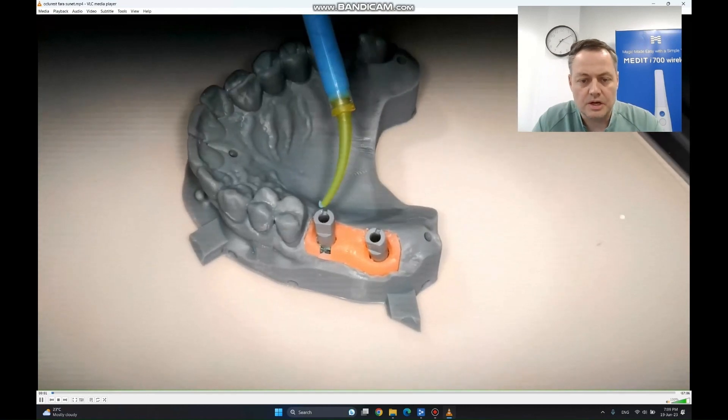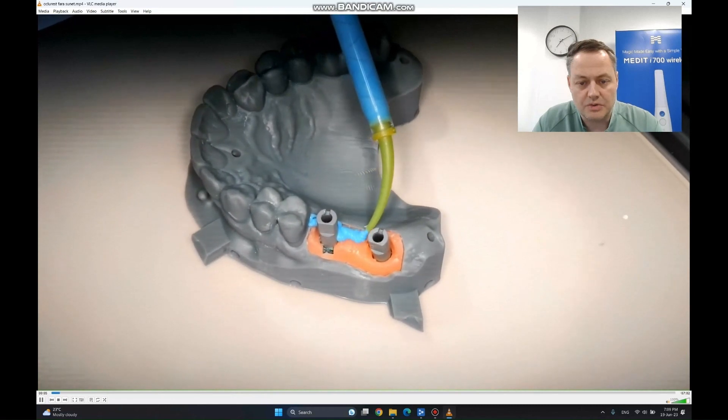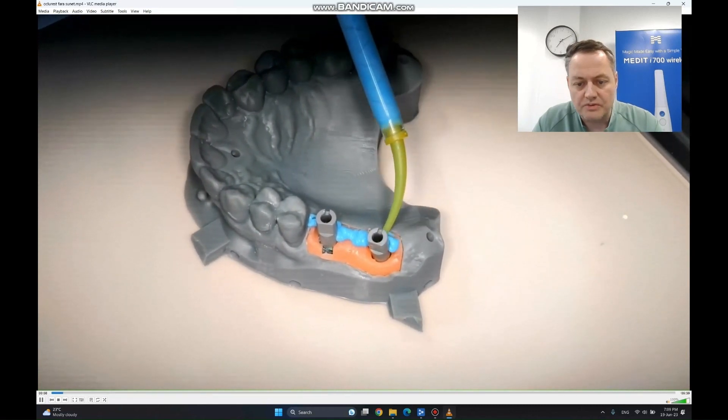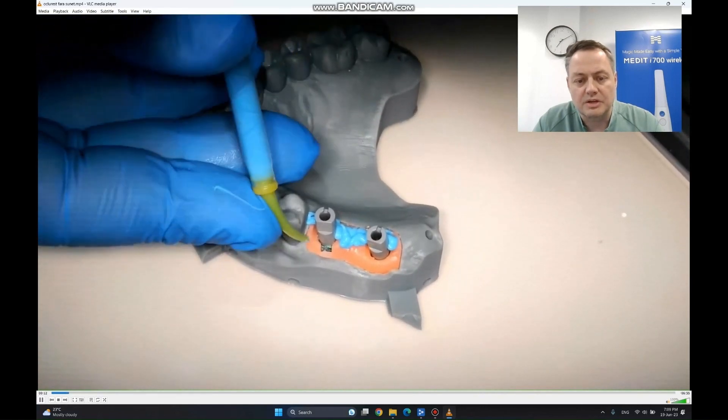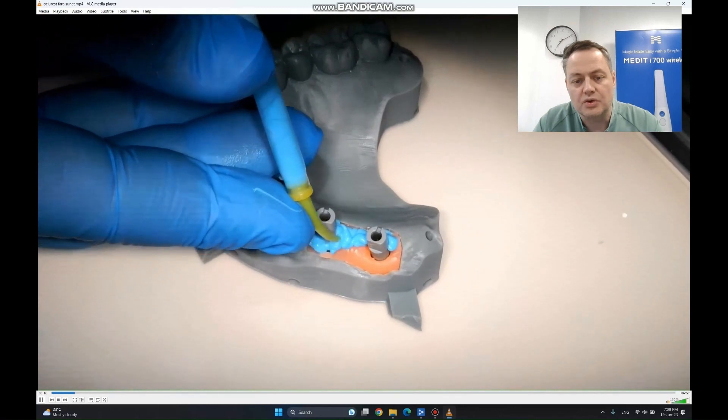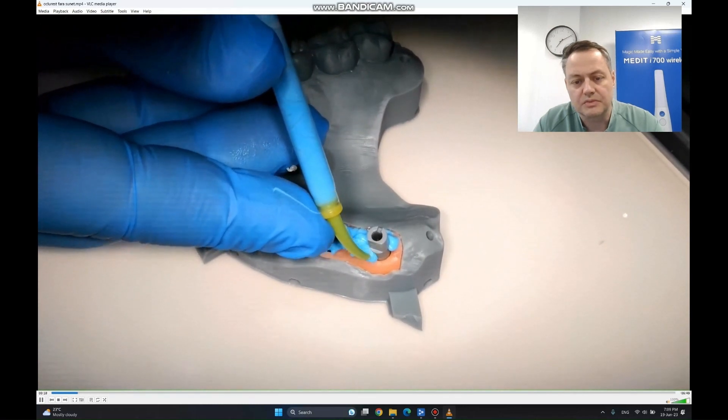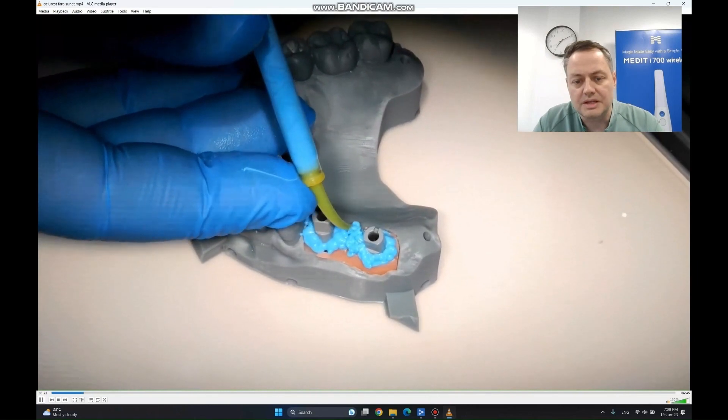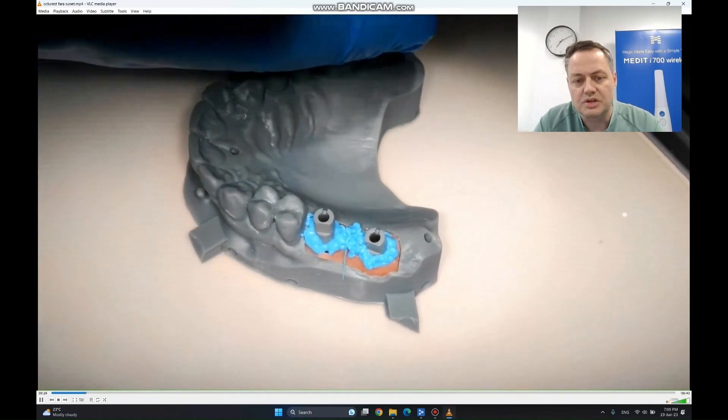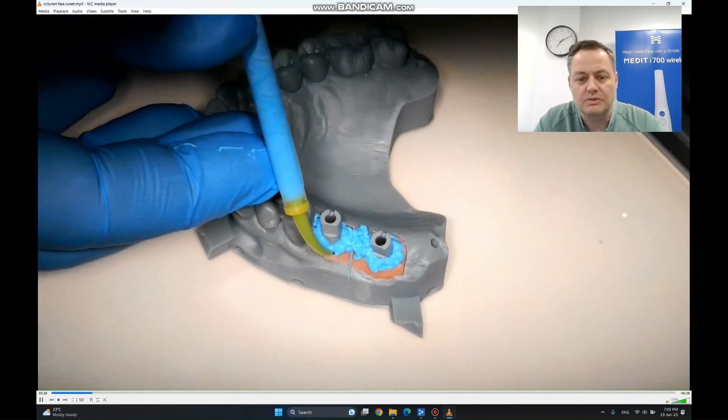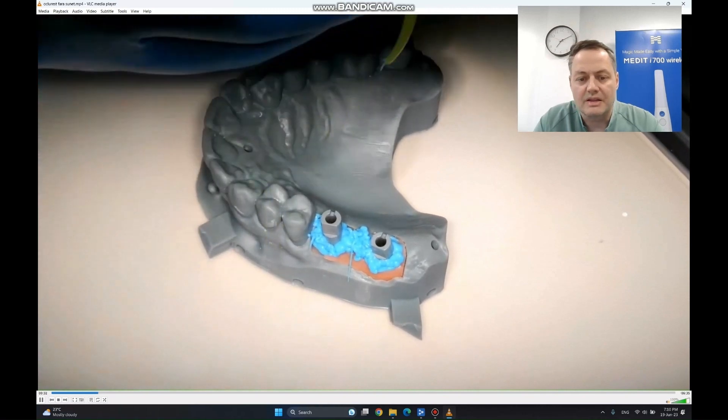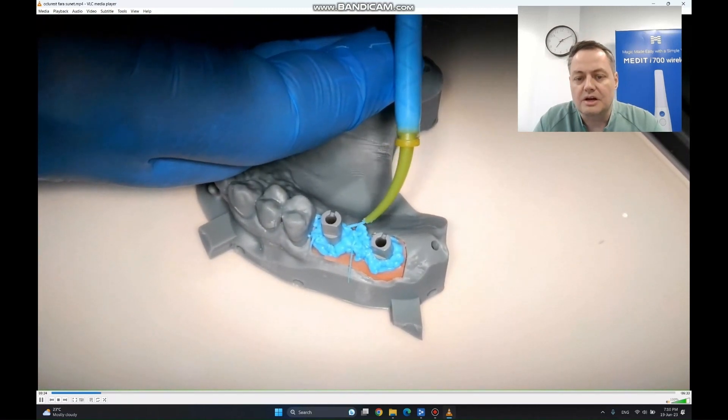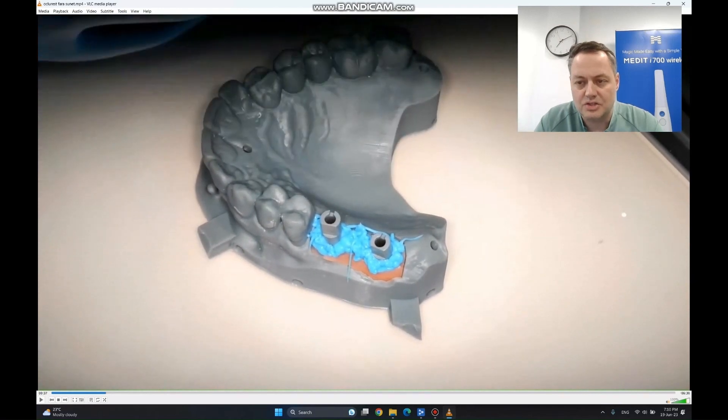We are going to see how we start adding this material around the scan body. If we are using scan bodies with an intermediate part that is not comprised in the library, you can cover this with no problems. If you are using scan bodies that use the whole surface for matching, please just set this material around their bases and thicken it around the areas that are between the scan bodies.